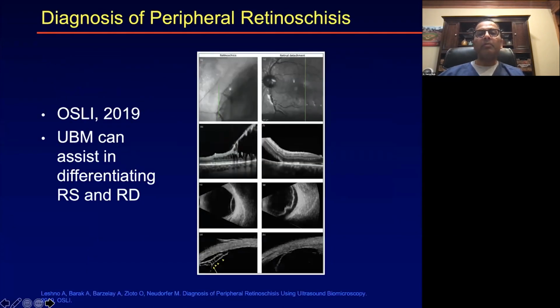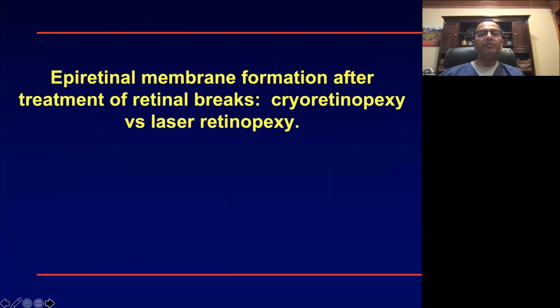And this has again been published in the literature. So we talked about cryo versus laser for retinal breaks. The question is, are there more epiretinal membranes in one mode versus the other? And we published data that I was sort of amazed to find. I'll give you the result: it didn't turn out to be true, whether we treat them with cryo or laser.